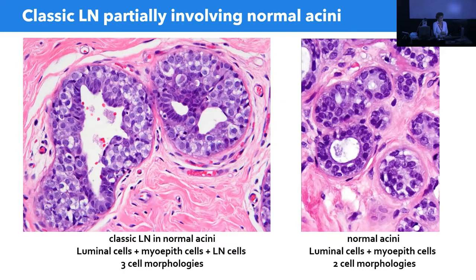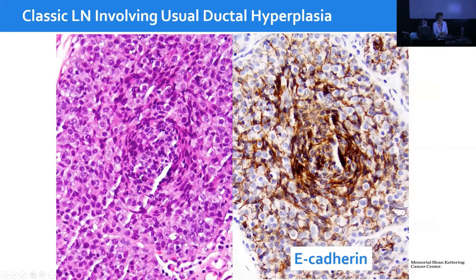Another situation is when classic lobular neoplasia involves UDH. Here is a proliferation with the streaming center characteristic of usual ductal hyperplasia, but with pale, round, fried-egg cells scattered throughout. When stained with E-cadherin, the result is negative — the positivity seen is from residual ductal cells and myoepithelial cells. The key is to find areas with two or more atypical cells and evaluate the membrane between them. The absence of staining confirms lobular neoplasia.